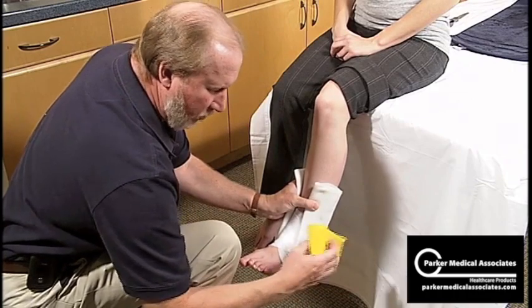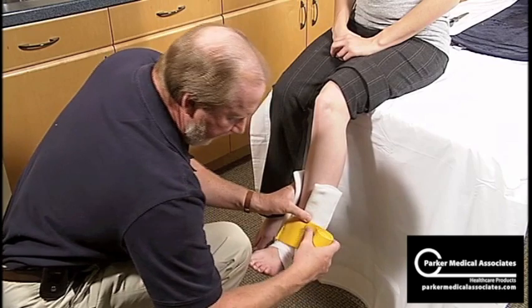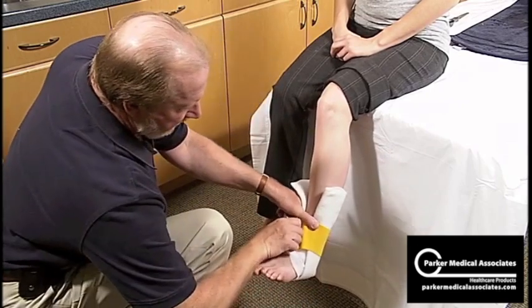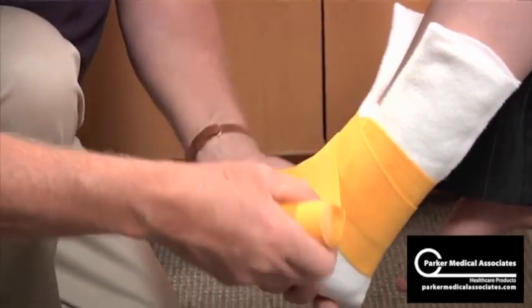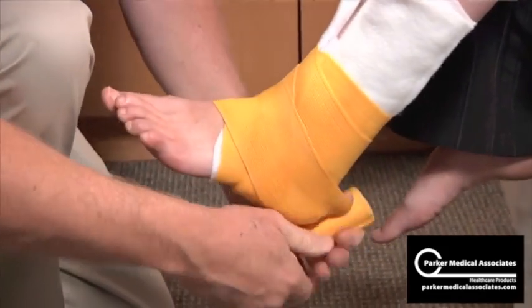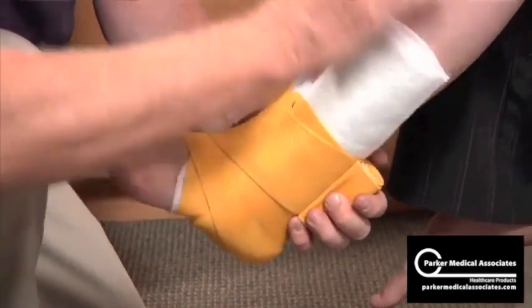Just take your bandage. Remember to roll off the bottom of the bandage. Just lock that in so it's on securely. Come around the foot with a little tension — a little more than normal. You want that compression. And just come up both sides.